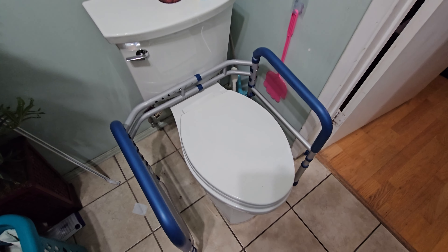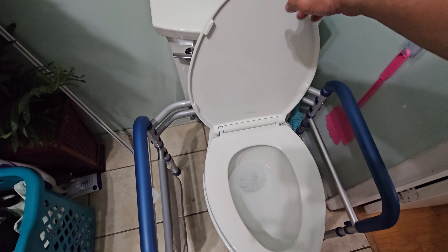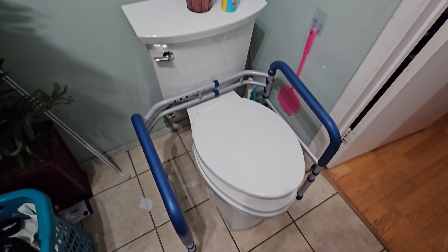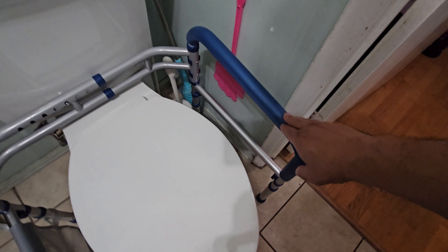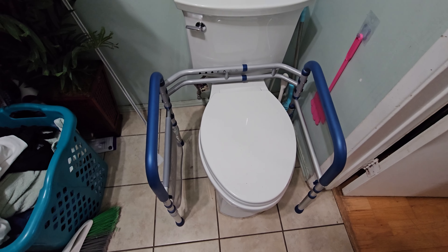Here's the finished product installed in the bathroom. You can open it up easily. You can also raise the handles even higher if needed — very adjustable.